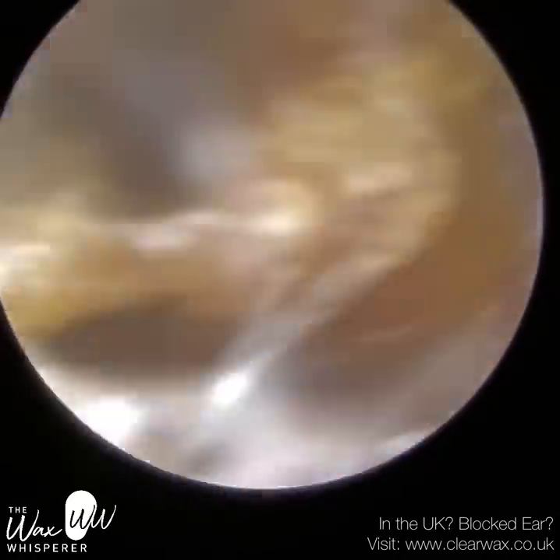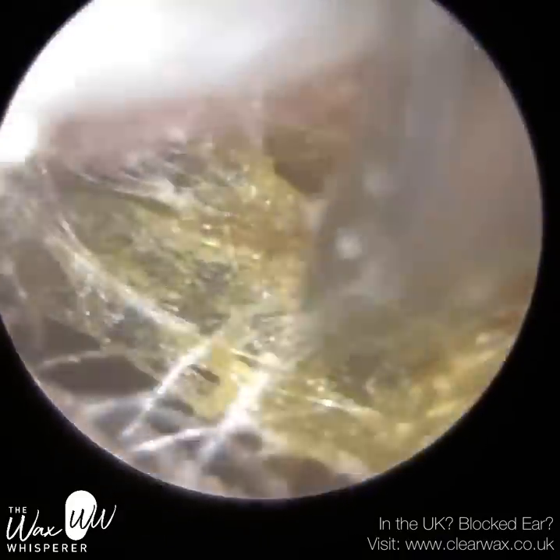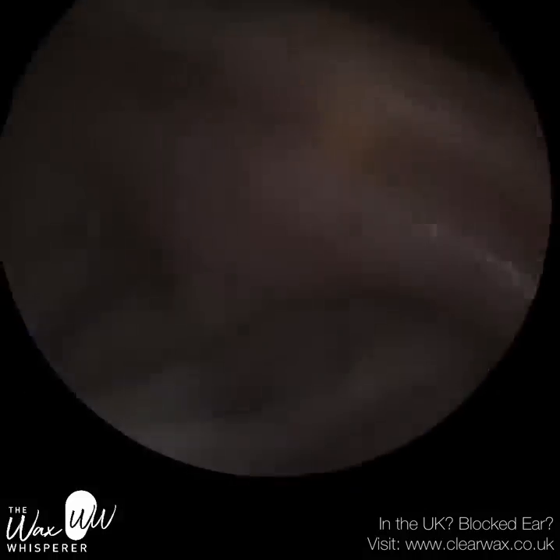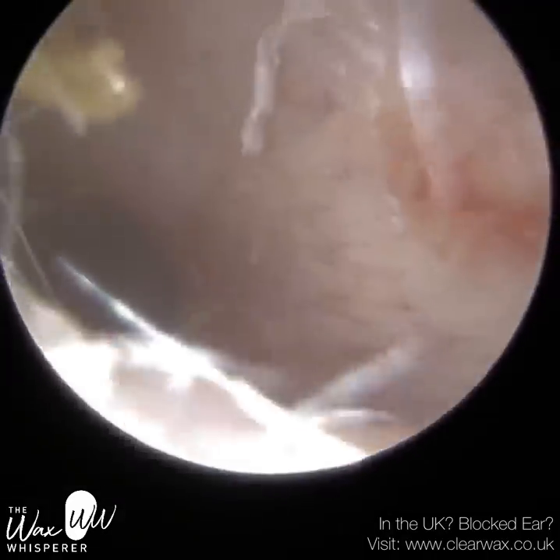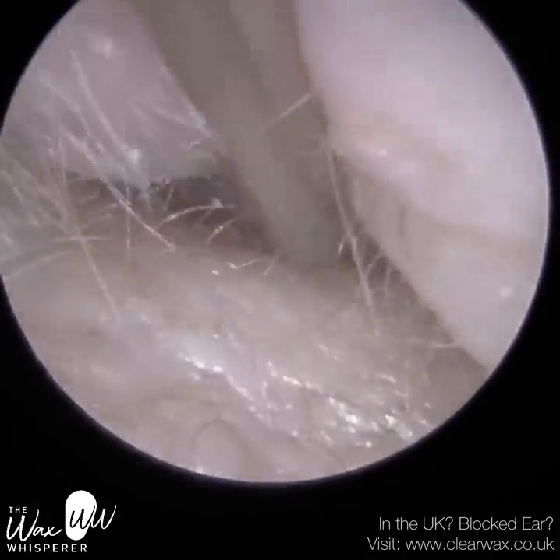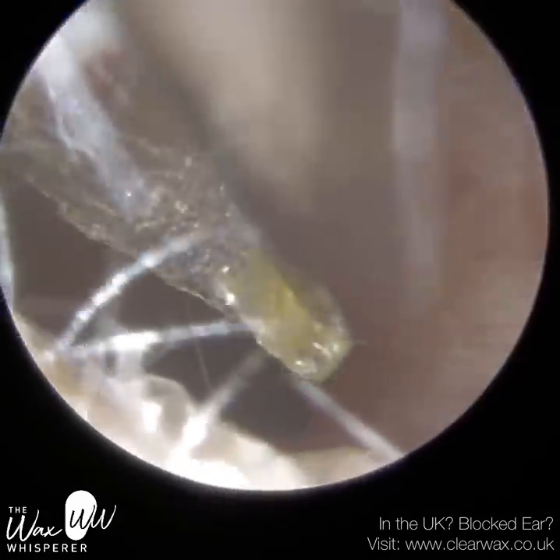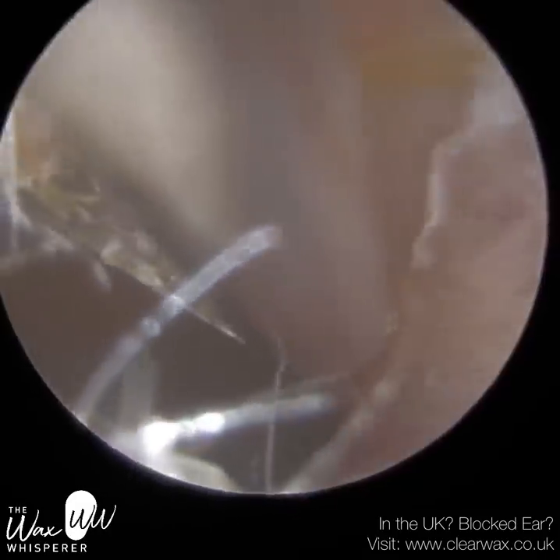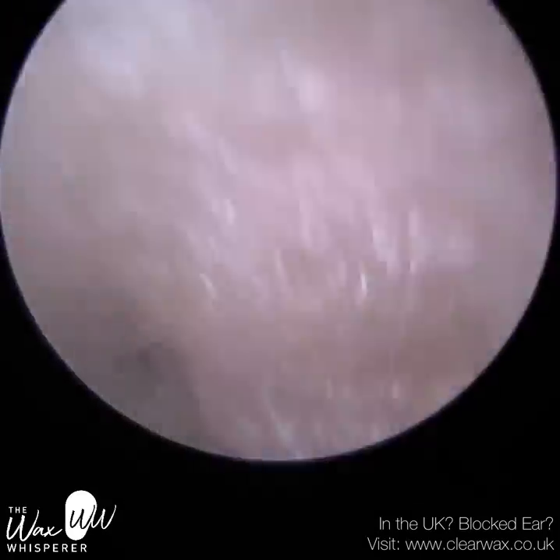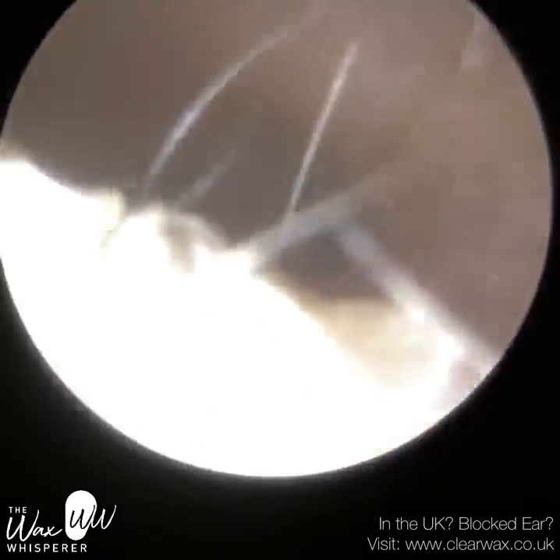The skin should migrate like a conveyor belt out of the ear. I'm just peeling down and away. Considering how narrow and bendy this ear is, we've done well to get a lot of this dead skin out. I'm going to go to the roof of the ear canal now and try to peel it down. You can see how bendy we have to really veer to the left. You've got a nice view of the eardrum, however.